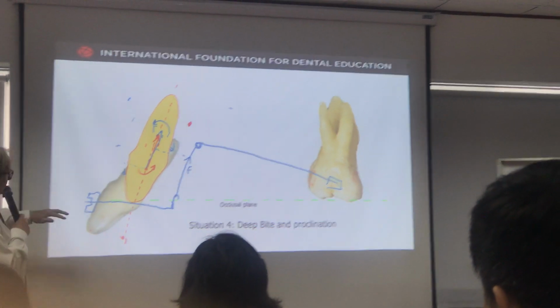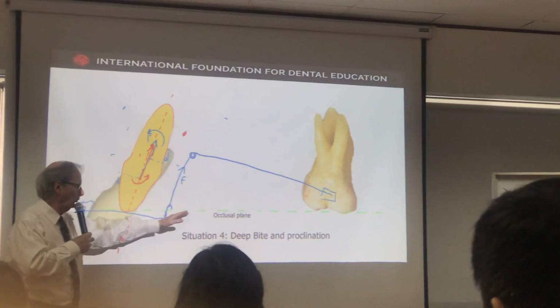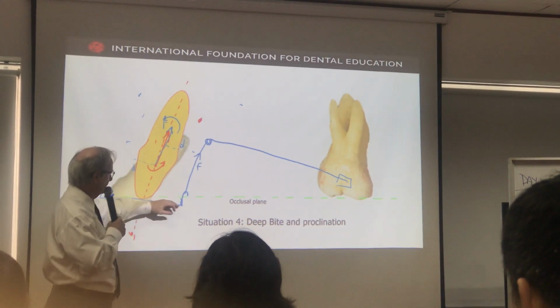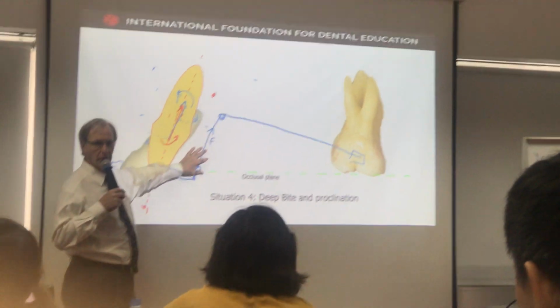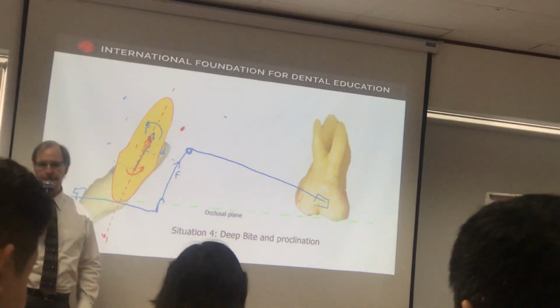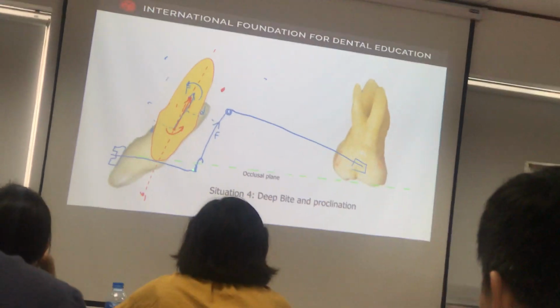So the trick with this is basically to vary the distance, either close, long. You don't want to be here, obviously, it's ridiculous, okay? And you vary the distance. The only difference, again, it's almost a straight wire system, except you cut it in the middle, and you just tie the things together. And by doing this, you get the right force system. Như vậy thì cách chúng ta khắc phục bằng cách là gì ạ? Đó là chúng ta sẽ mở rộng cái cánh tay đòn ra phía sau.